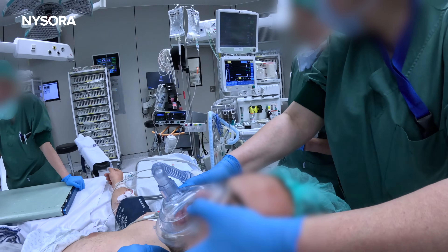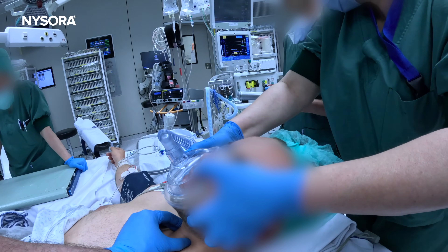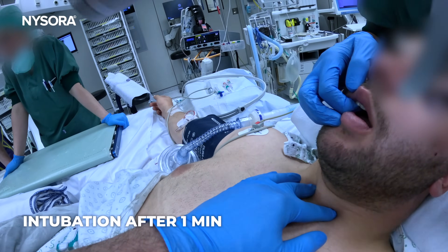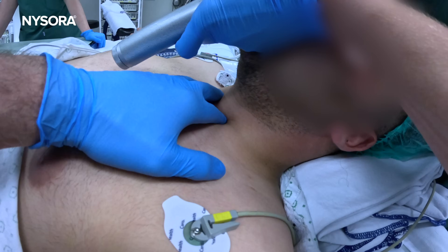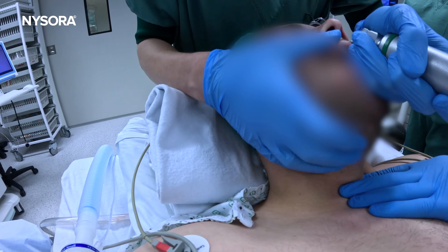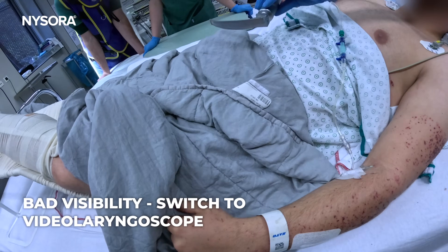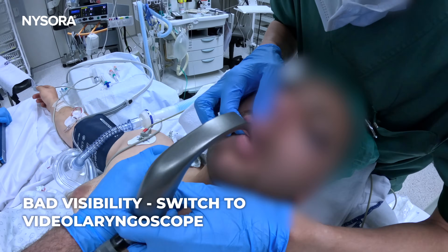What is the time? 55 seconds. One minute. The O2 sat has now dropped to 99. Let's take a very gentle look here. Okay, so that's Cormac 3. Can you see? No. Then take the video laryngoscope. Saturations at 98.